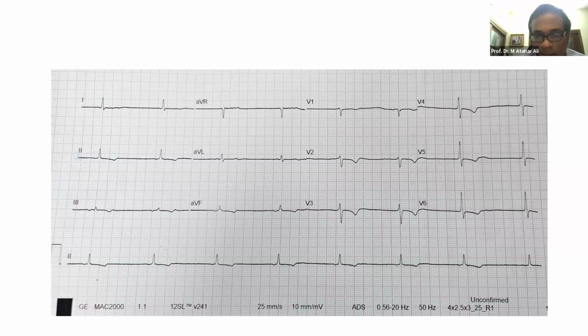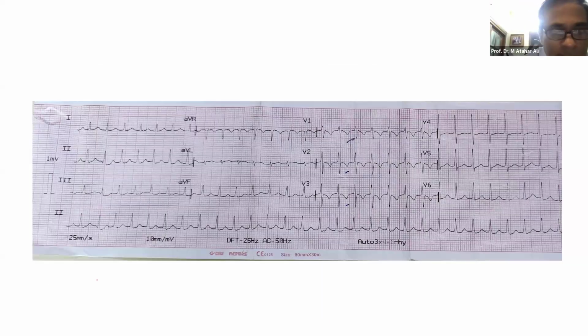Shafique, one explanation may be that the patient had baseline hypotension before giving the verapamil, or the patient had already got verapamil, and on giving the second shot of verapamil the patient may have developed complete heart block. These two may be the explanations for the cardiac arrest and thereby intubation. That could be; actually I was not there. And this is the junctional escape rhythm, as Jamil says. This is again in favor of the complete heart block that the patient may have developed, as this is a junctional escape rhythm.